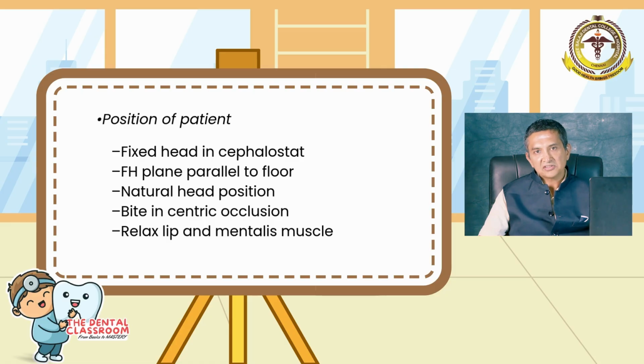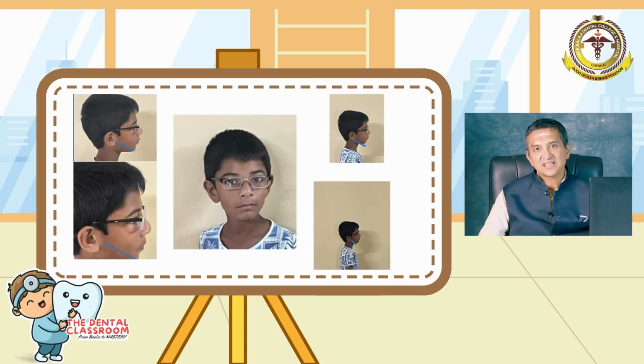The first important objective is that we do not take the frontal view, which is what we see in the photo, but we take a lateral view. This is a fundamental diagnostic understanding that we treat the patient as we see from the sides. However, the patient always looks at himself or herself from a frontal view, and this is one of the biggest disadvantages of a lateral cephalogram. The patient looks at the face from a frontal view, whereas we take all parameters in a lateral view to treat the patient. I told you about the standardization.